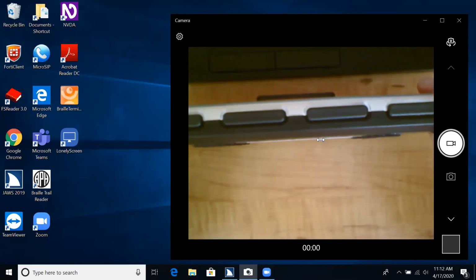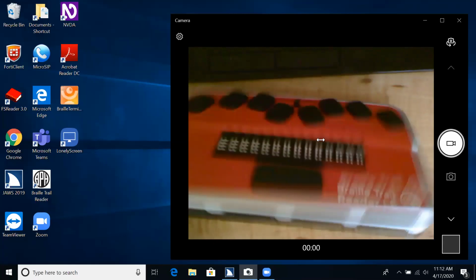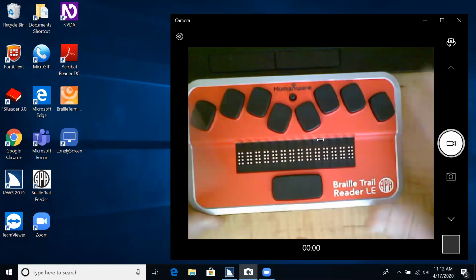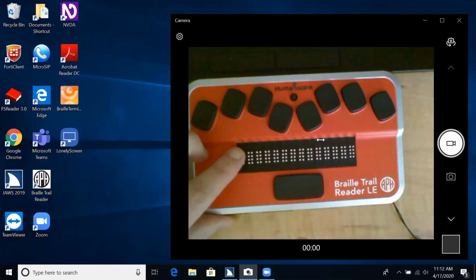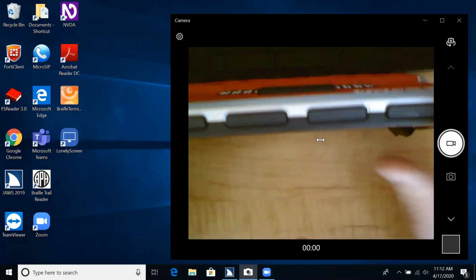work to pan the Braille display. By panning the Braille display, I mean to continuously read, right? If we think about the device as having 14 cells, we know that we're only reading 14 cells at a time, and a typical line is going to contain more than 14 cells of text. So we're going to use that inner thumb key to scroll or to pan the Braille display.